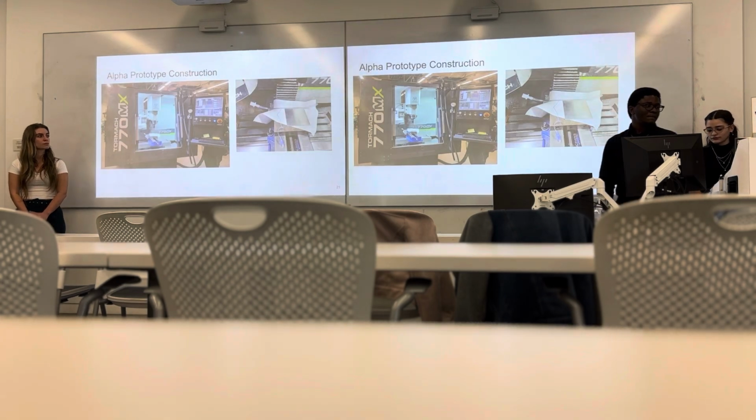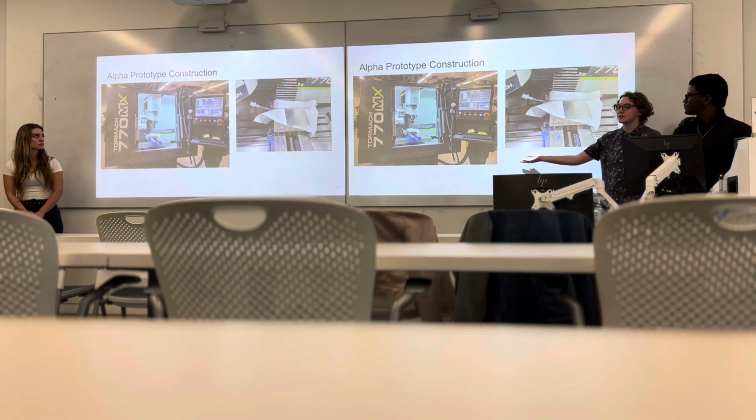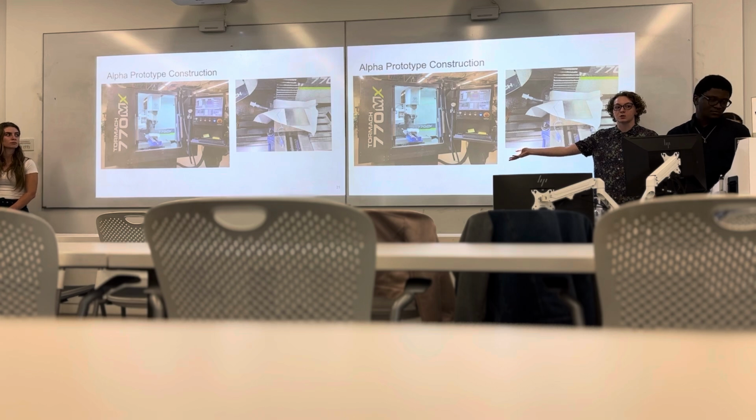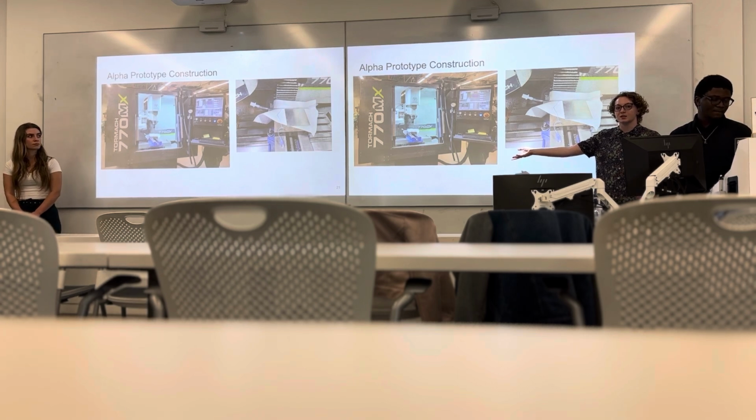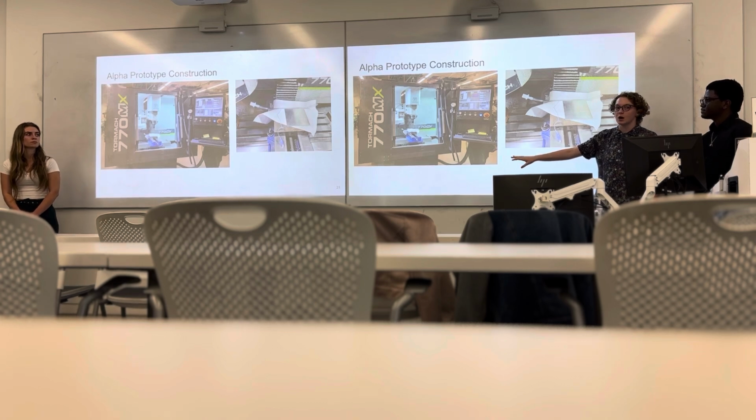Alright, so this is the CNC machine that Logan mentioned earlier. This is how we got our very precise holes within the catheter that is in the main tube. And then we also use this same machine for our final prototype.